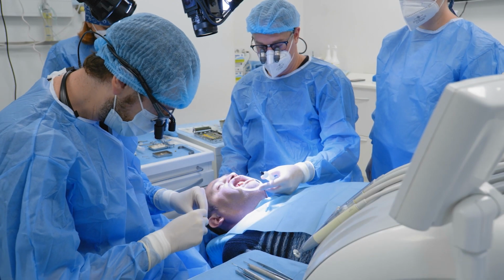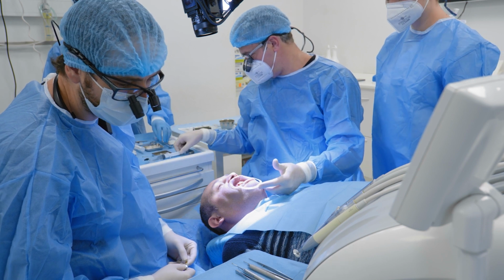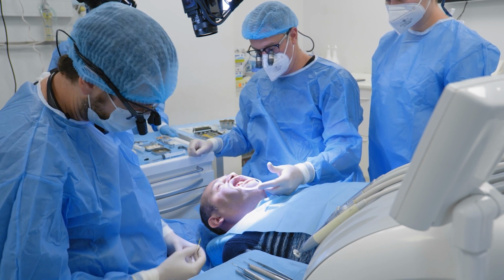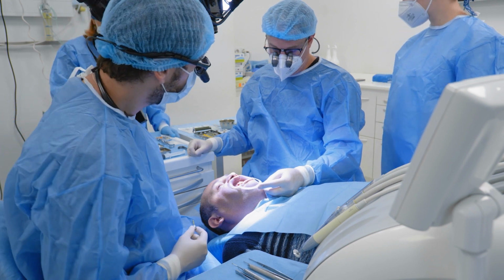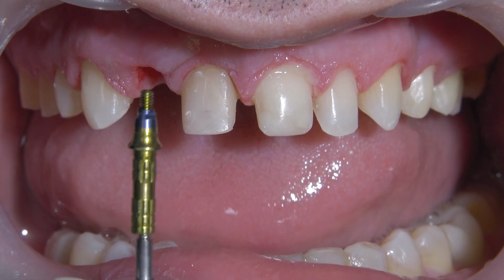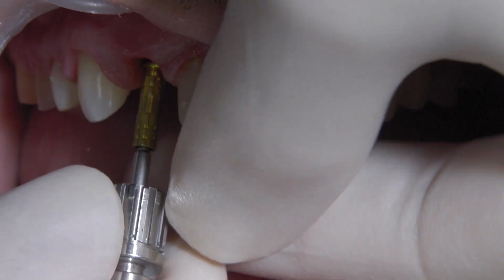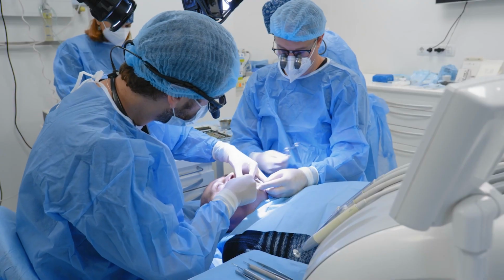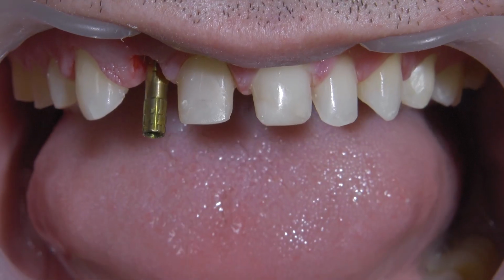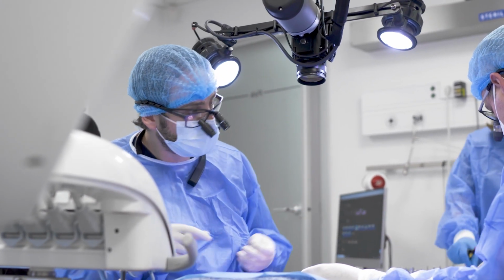As Florin said and I said, the main point of doing both options is for you to decide. So imagine if you don't have a lab, you did everything before, now it's time to do everything in the mouth. So I take the provisional cylinder, okay? I go in. Let's try the provisional with the cylinder in position.